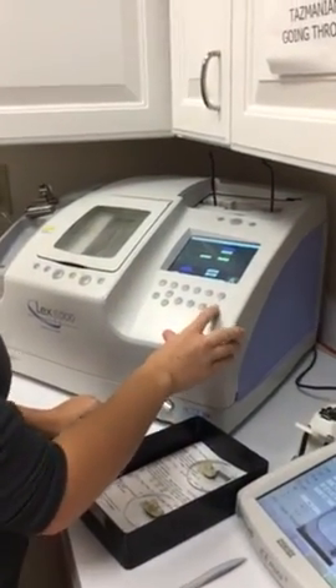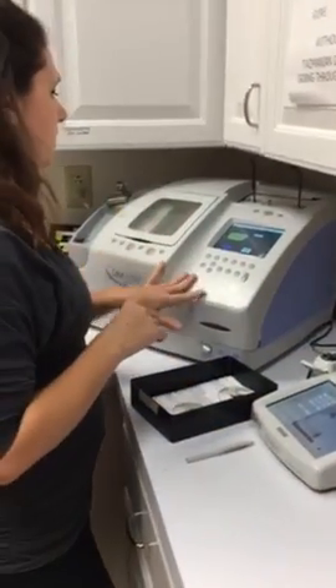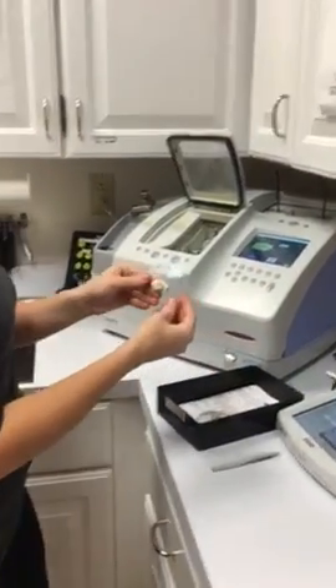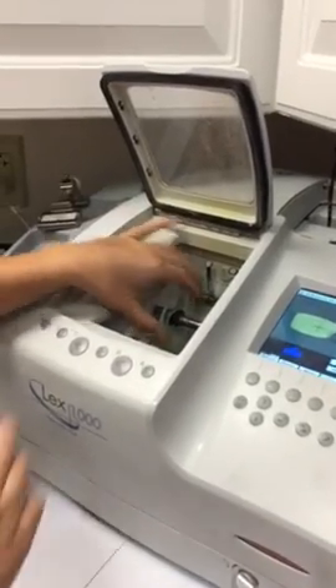So now I'm going to press this data button. It takes the data here and transfers it to our edger, and then it starts with the right lens. I just take the lens, put it here, and I chuck it — so it holds it together — and I press start.